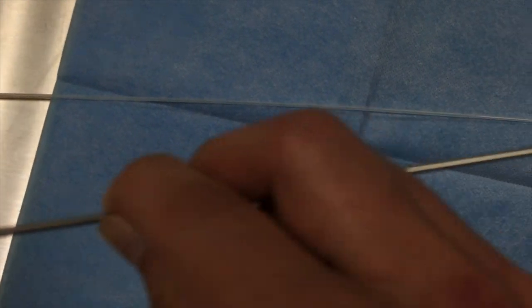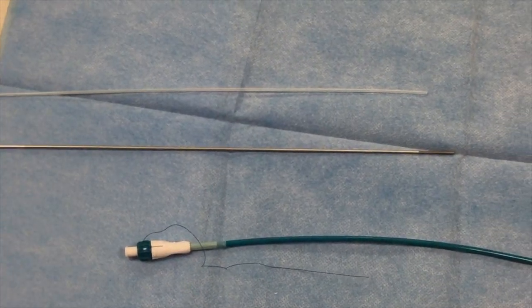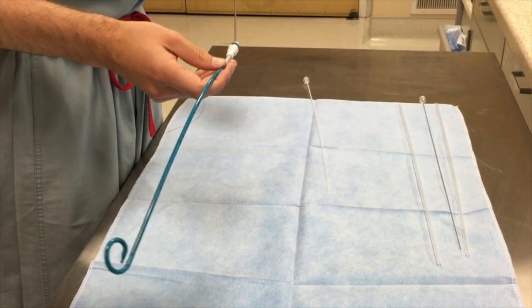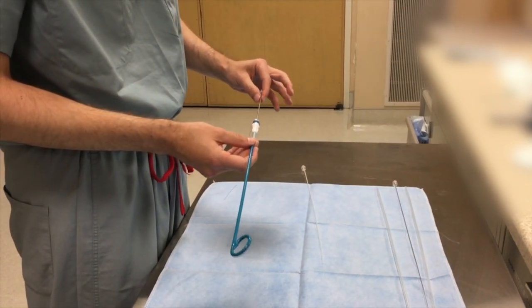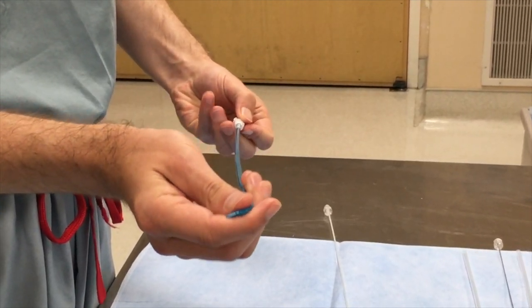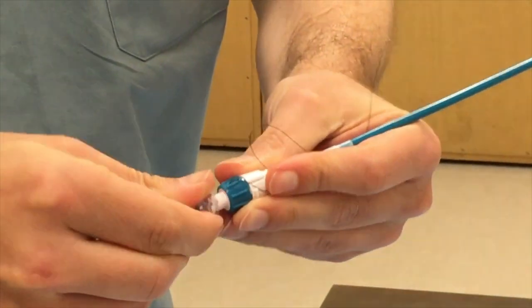Depending on what you're going through — whether it's a new track or an old track — this is something you should confirm with your attending or fellow. You'll take one of these and place them through the end of the catheter. So you go ahead and place the metal in here, push it through, have it come all the way down to the end, and then secure it on the back end. Go ahead and tighten that and then it'll be ready to go.